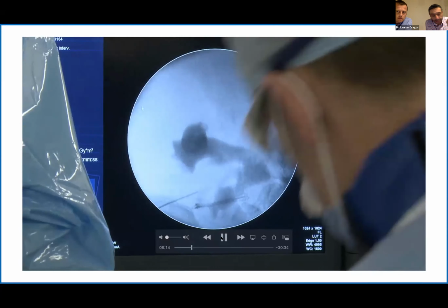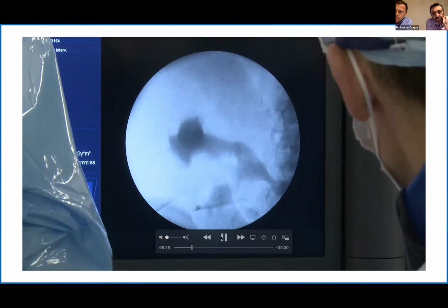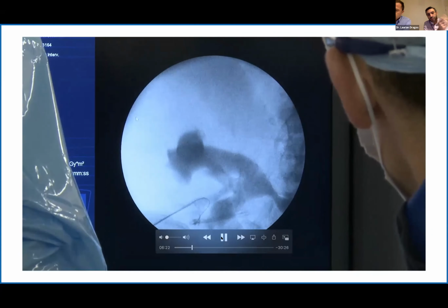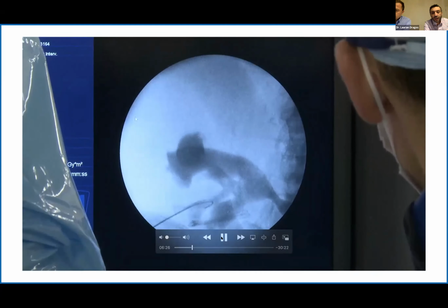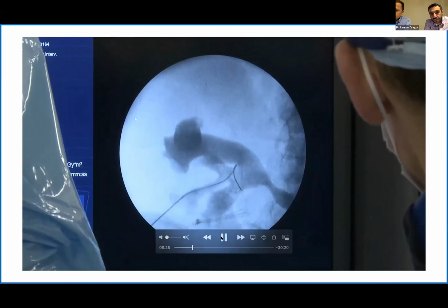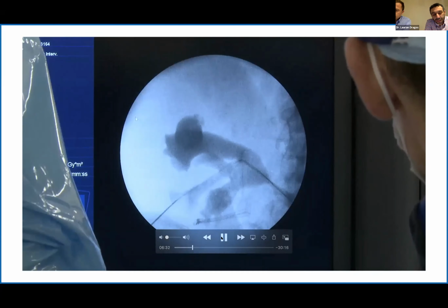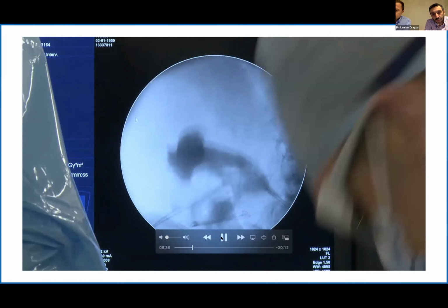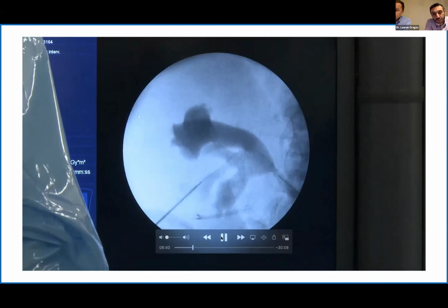And our radiologists, as you can see, use a combination of ultrasound and imaging in order to get the best access. For example, in this particular case, we had already discussed whether we should go for the upper pole approach, mid calyx, or the lower calyx. But if you take your mind back to the original CT scan, the lower pole was more anterior, and also it was surrounded by colon, which would have been very difficult.